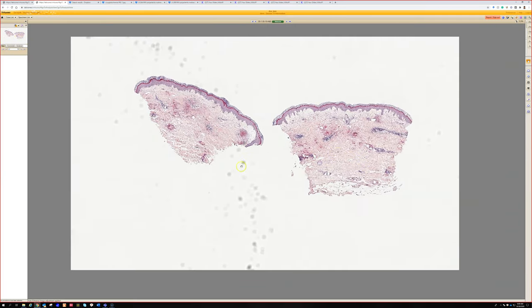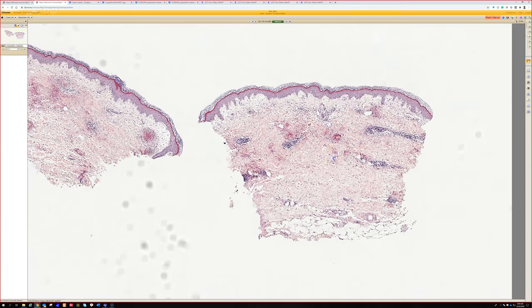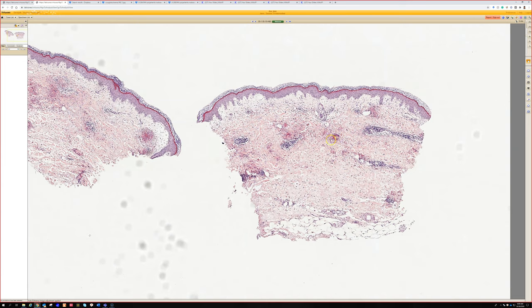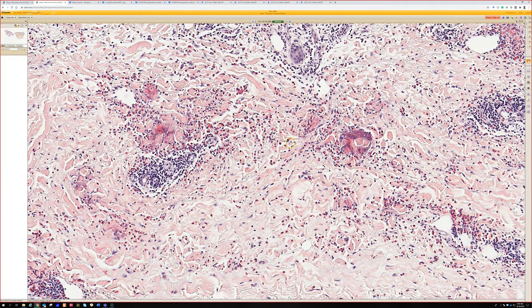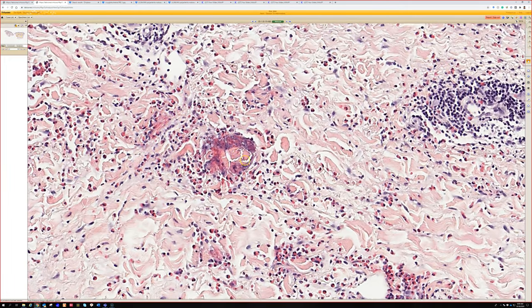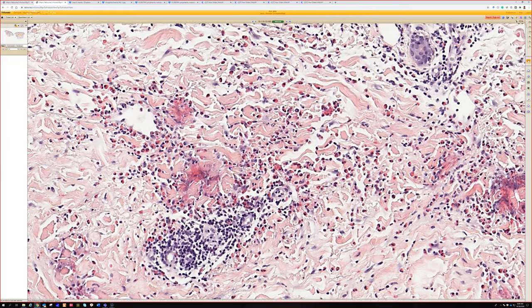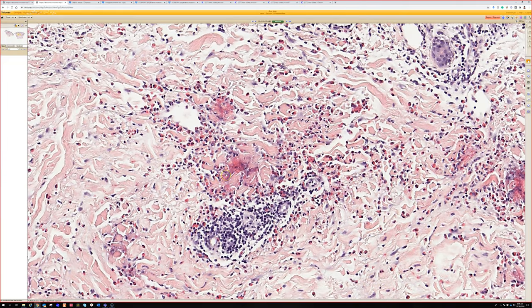The key here of course is the flame figure. Even from 0.5x on this scan, you can see them — these bright pink, orange-purple blobs in the dermis. The degenerated collagen sometimes seems to almost float in the middle of them. When you have numerous eosinophils, they begin to degranulate, the collagen kind of dies and gets coated in the granules. All this bright flame stuff is eosinophil granules coating the dead and dying collagen bundles. Anytime you see a ton of eos, start looking to see if you can find some flame figures.